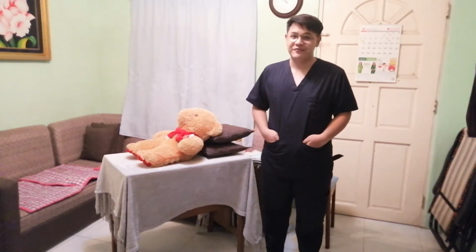Good day, everyone. My name is Christina Lam Sumawang, and I am a student nurse from Tarlac State University, BSN 1B. Today, I will be performing a performance checklist about transferring a patient from bed to chair or wheelchair. The goal of our performance is that the transfer is accomplished without injury to the patient or the nurse, and also that the patient is free from any complications of immobility. So now we will proceed to our procedure.